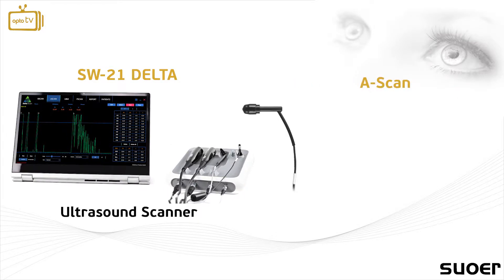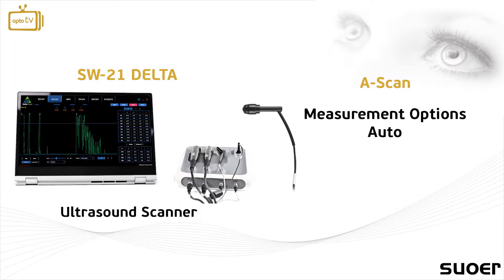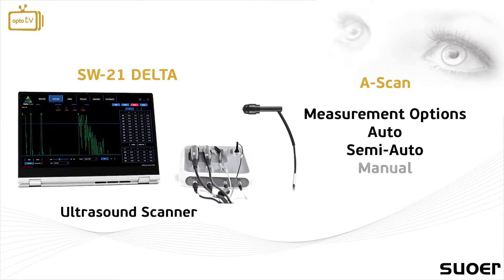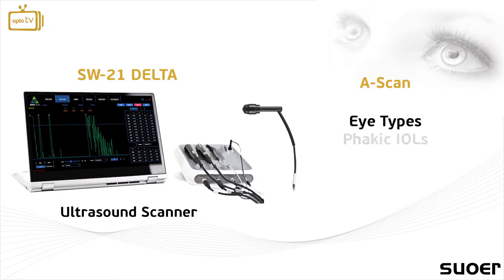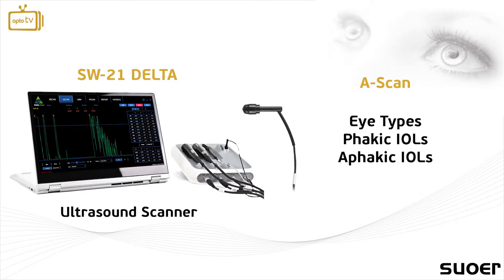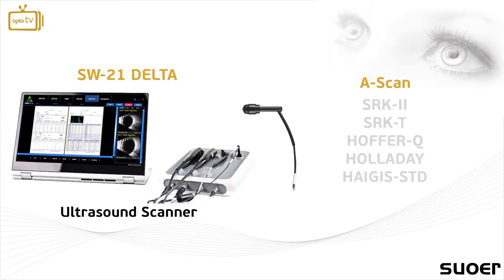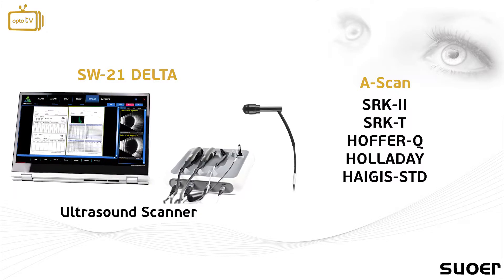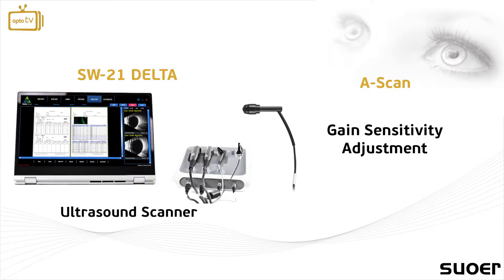The A-scan offers a 10 MHz probe that allows the user to choose between auto, semi-auto and manual measurement options. The user can also choose between eye types of PHAKIC and APHAKIC IOLs while utilizing the IOL calculation formulas in the software. Additional adjustment to the gain sensitivity provides a more effective measurement.